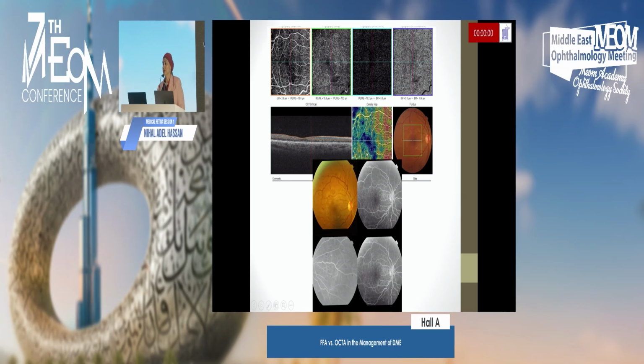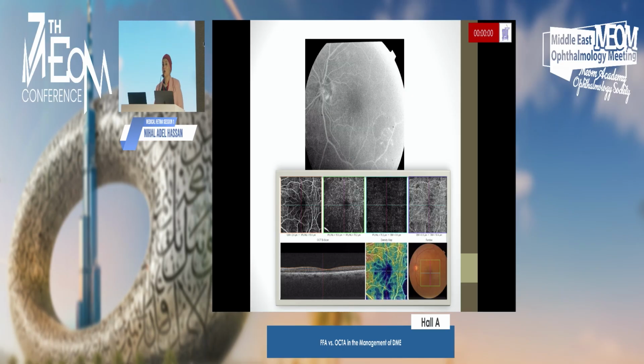OCT angio will show the hypoperfusion in the vascular density map, but in the same patient, I did fluorescein angiography showing the ischemic areas in the retinal periphery, putting him in severe non-proliferative diabetic retinopathy, though in the macular area there was no obvious manifestation. Another case, fluorescein angiography showing the paramacular capillary dropouts with early new vascularization at the disc.